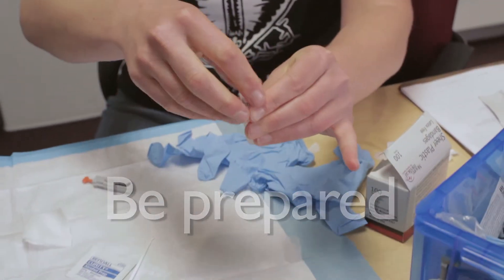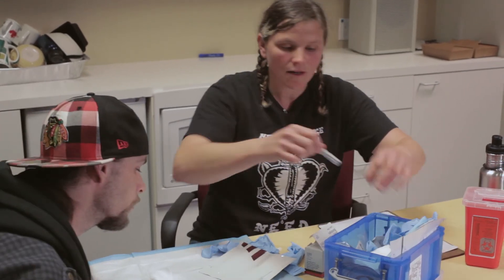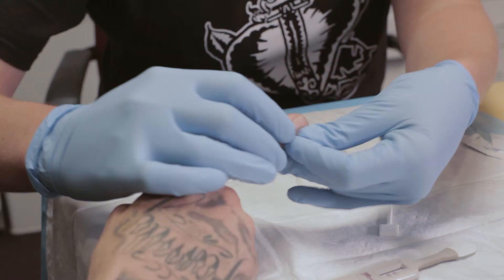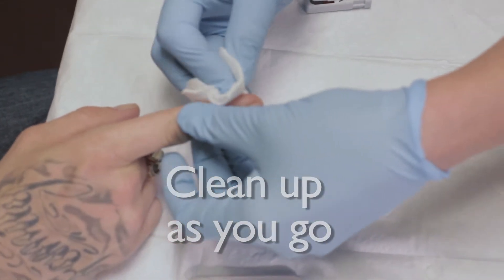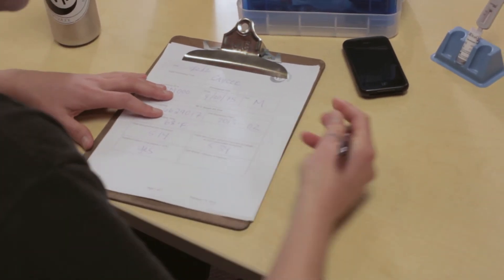Here are some of the simple things that we've learned at UFO that make the testing process a little easier. Be prepared — have everything you need to conduct the test ready before the participant arrives, like our caboodle. That puts them at ease and increases confidence. Ask them to move their arm; that helps the blood flow to the finger. Use the side of the finger — ask participants if you can look at their hands, as fingertips have more nerves, which means more pain, and are often calloused and not good for finger pricks. Clean up as you go — you can use the 20 minutes while the test is going to clean up the space, fill out your paperwork, and get ready for disclosure, pulling together any referrals or materials that may be helpful.